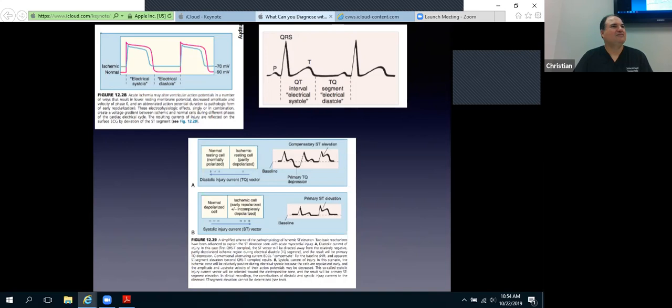Are you going to get into bundle branches at all? Not too much, but a little bit. Okay. Into how to diagnose a STEMI with a bundle branch? Yeah. Well, I mean, how do you differentiate an acute STEMI when someone already has that bundle that throws everything off? Like, the bundle gets misread sometimes as a STEMI.